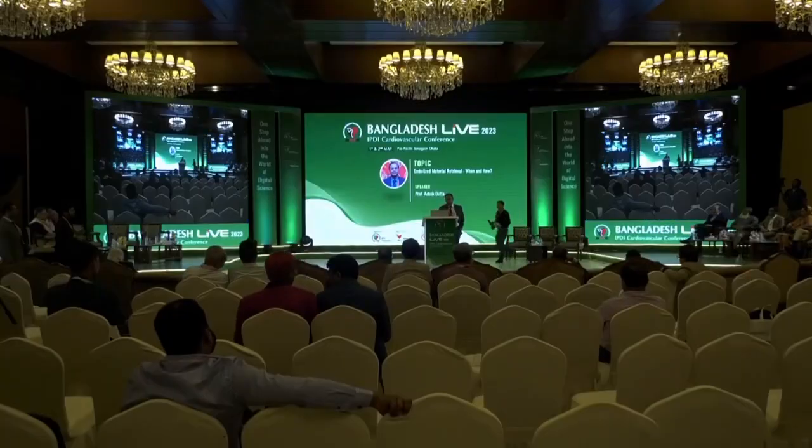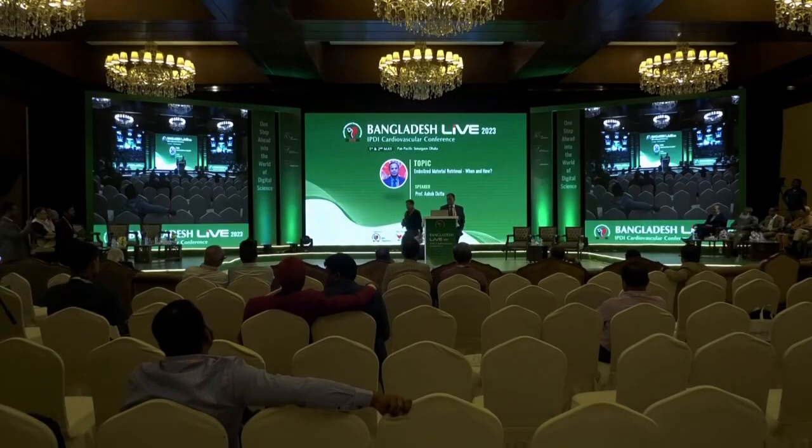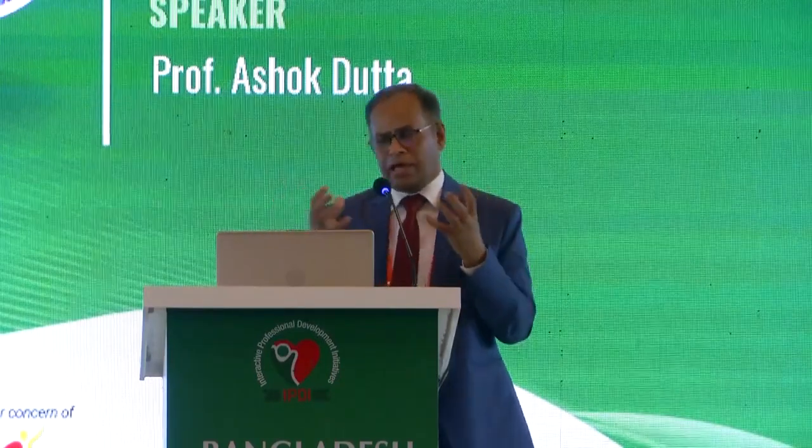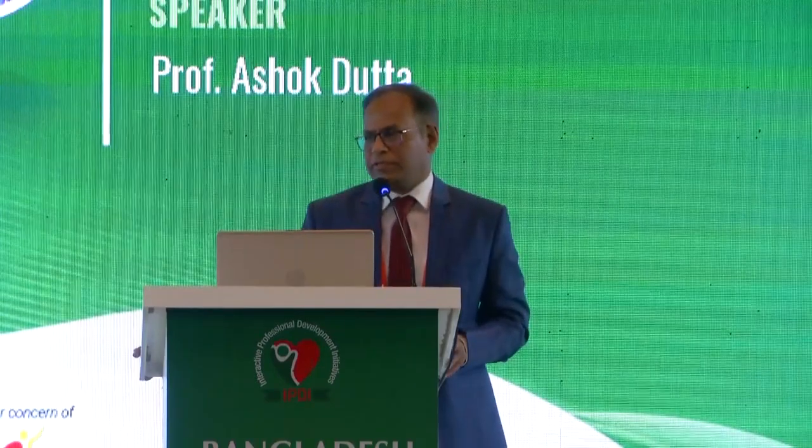Yes, that is very important. But actually, I would like to take some opinion from the senior Dr. Shet sir and Supya madam, and all others are here. Dr. Arun is also here. There is a temptation that a small push, a small pull may complete the procedure like this. How many of us try to avoid this temptation? Sir, my coach was telling me not to push or pull anything inside the coronary or any artery against resistance.